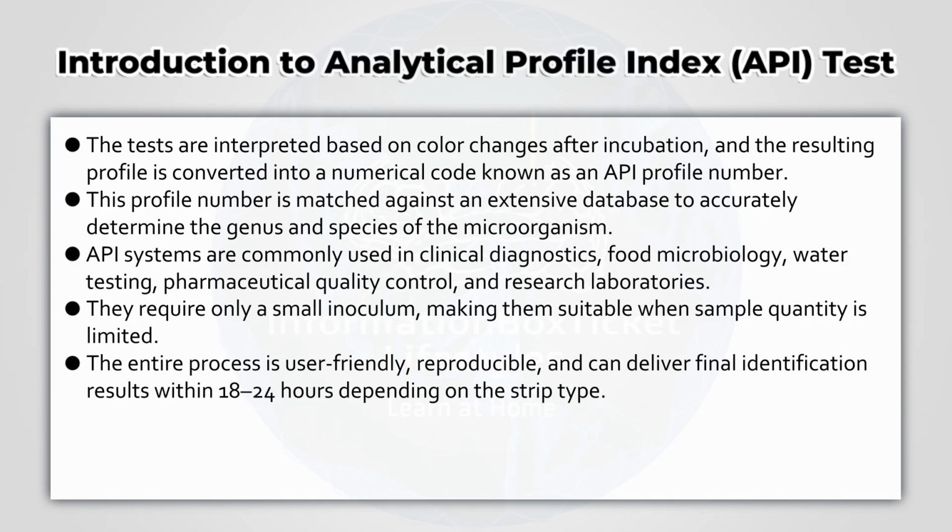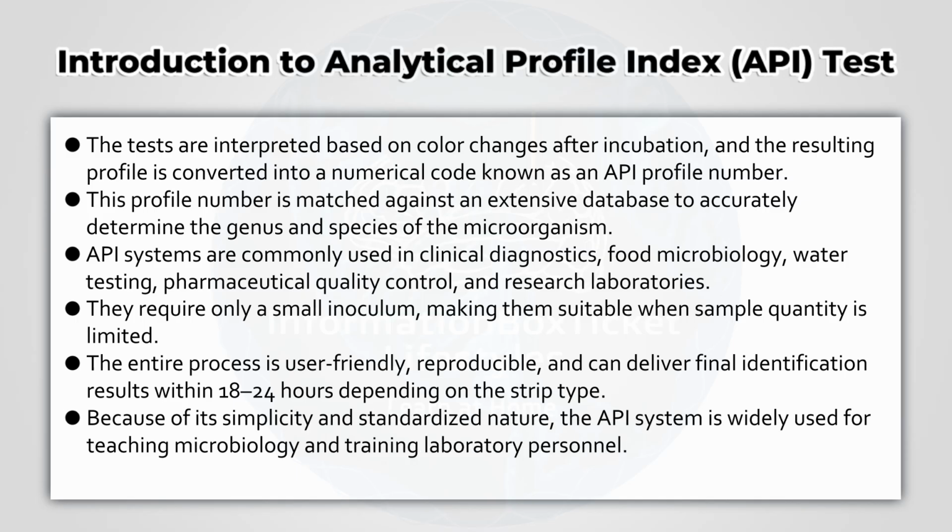The entire process is user-friendly, reproducible, and can deliver final identification results within 18 to 24 hours, depending on the strip type. Because of its simplicity and standardized nature, the API system is widely used for teaching microbiology and training laboratory personnel.